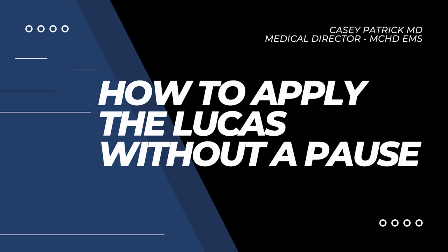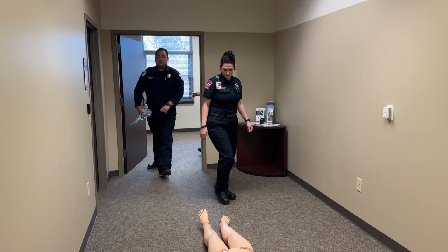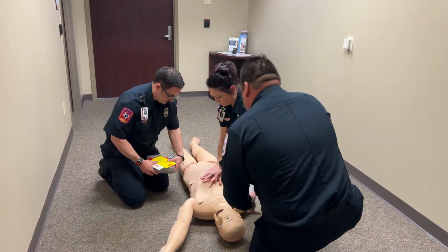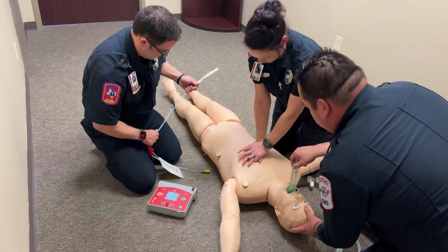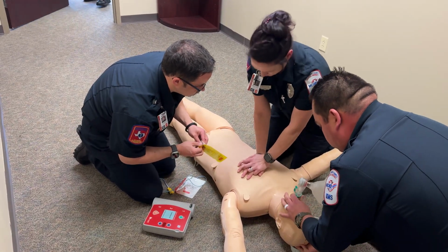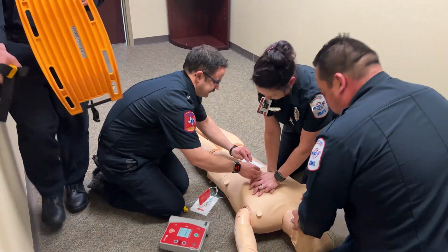Hello, everyone. Thanks for taking a second to watch our Lucas transition guide. This is in effort to minimize the pause times that we're seeing across the county when we're placing our Lucas devices. And as these continue to move onto the trucks and become a presence for all of our paramedics, all of our first responders in the county, we want to give you a guide as to placing the Lucas device with the minimal amount of pause possible.